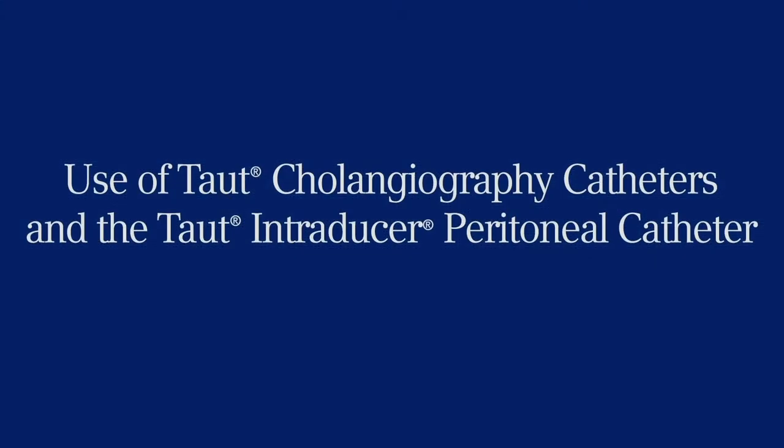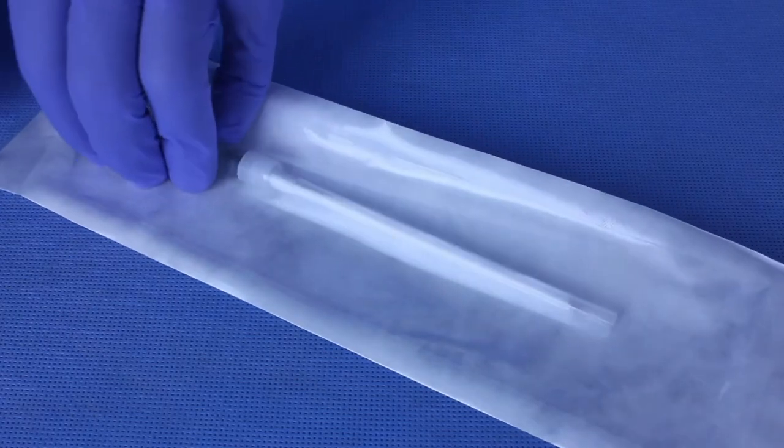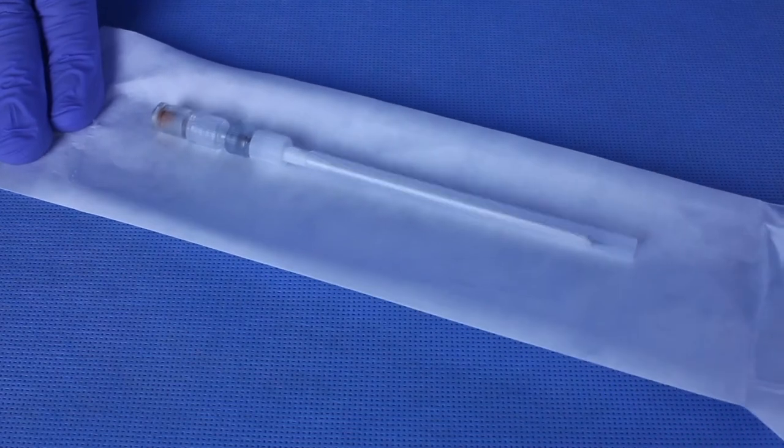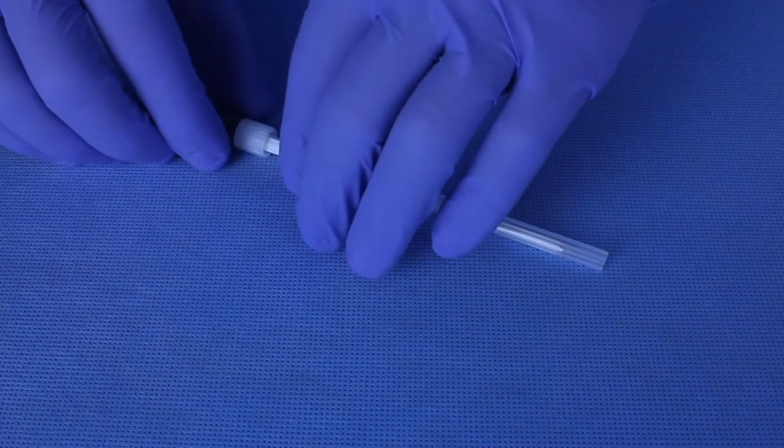Use of taut cholangiography catheters and the taut introducer peritoneal catheter. Using accepted sterile technique, remove the introducer from package. Remove the protective guard from the catheter and needle.